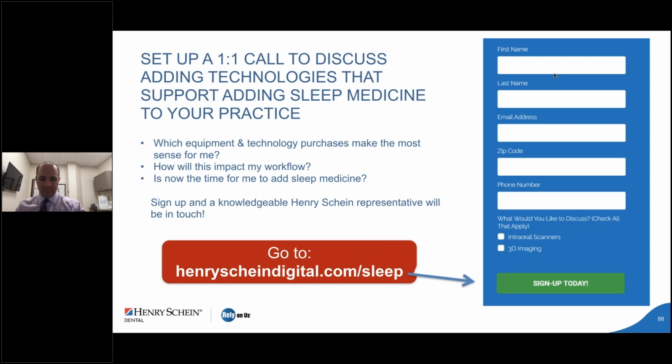If someone has a 2D imaging unit, will the case conversions be that much different than if they had a 3D imaging unit? Personally, I couldn't crack it. I really enjoy having that 3D image, and I find that tremendously valuable in evaluating these patients with TMD, craniofacial pain, and apnea. It's super valuable to look at all three dimensions of the condyle.